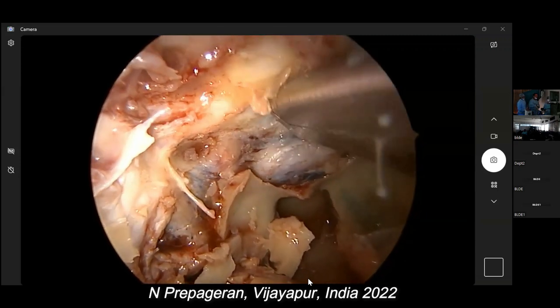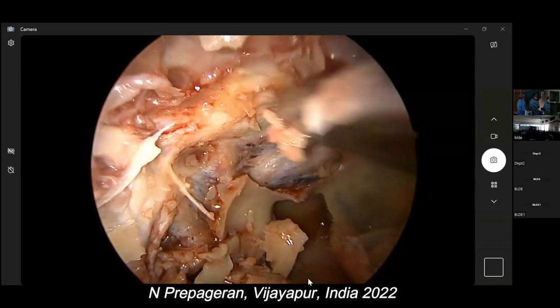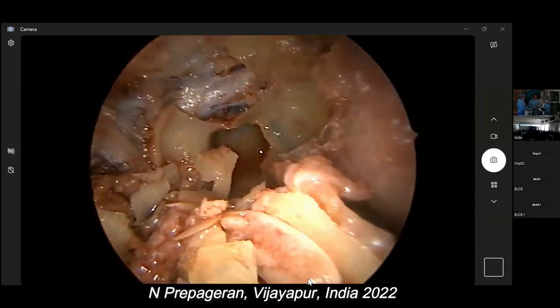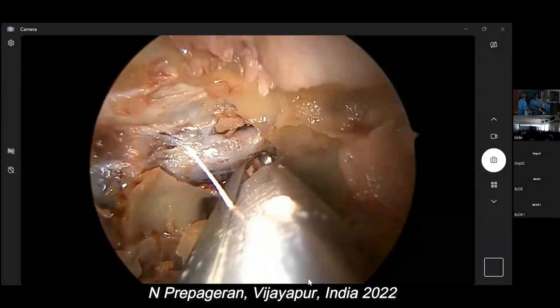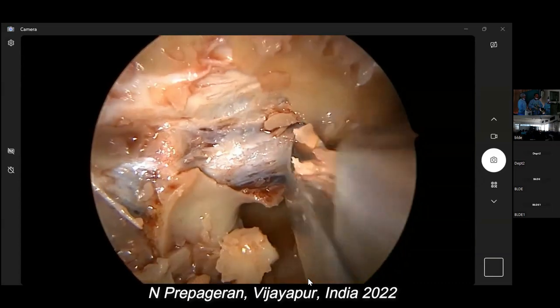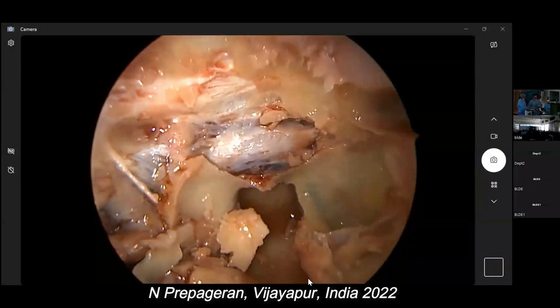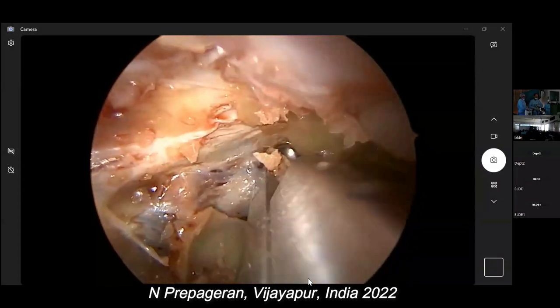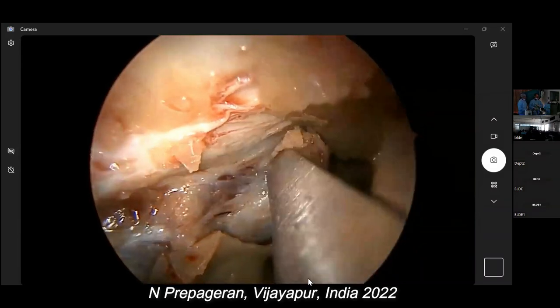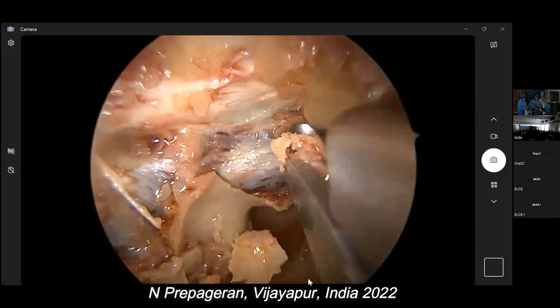So now you see, we're coming to planum. Even back home, when I do skull base, I do the same. I drill a little bit, find an opening, and then use a Kerrison punch, simply because drills are very precious for us. I work in a government institution. We don't have the money that you guys have. I thought some of you own private hospitals here. So do the same as I do then, yeah?